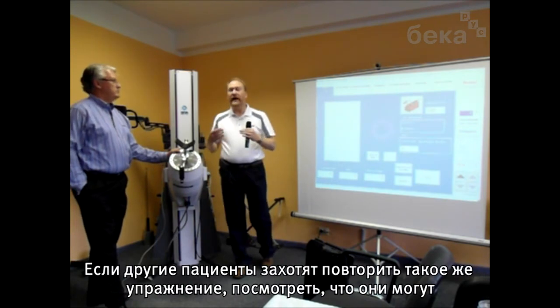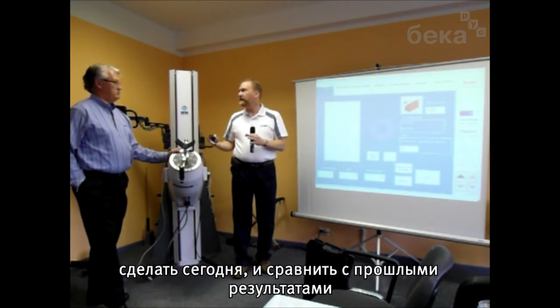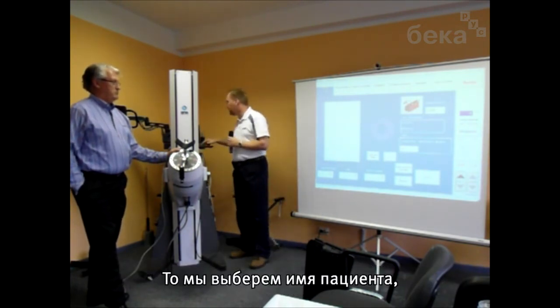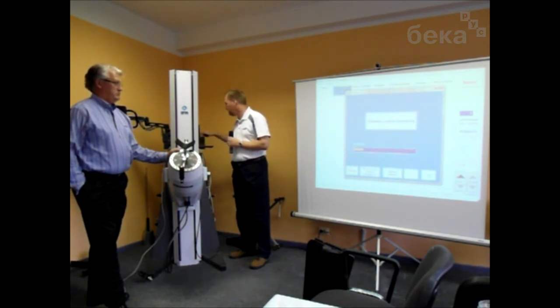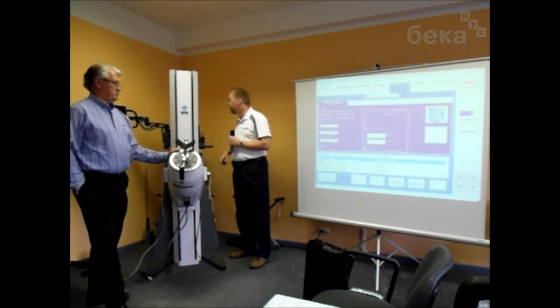And then when they come back the next day, we want to repeat those exercises. We want to see what he can do today compared to what he did the last time he was here. So we will select that person's name, bringing up their record. We'll go to the treatment setup.